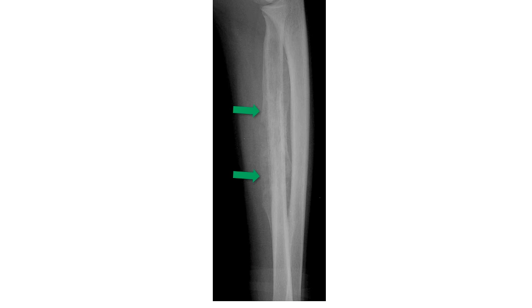To start with, this is a 14-year-old male who presented with forearm pain. A plain radiograph shows a permeative lesion at the radial diaphysis which is associated with a prominent periosteal reaction as shown by the green arrows. This periosteal reaction is interrupted and not continuous and has the appearance of onion skin. You can appreciate also cortical thickening and within the marrow, the lesion is lytic, polymogenated with a permeative pattern that is without a beginning or an end.